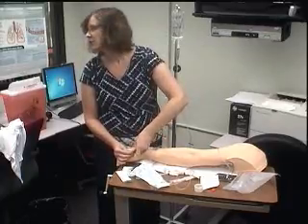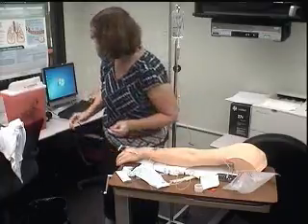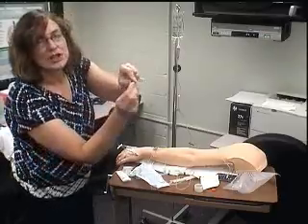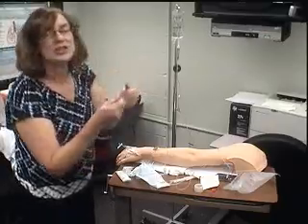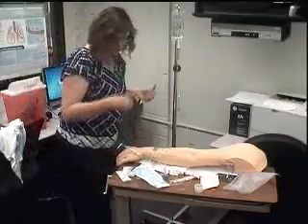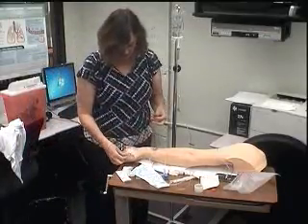Usually it's like 20-30 seconds. Scrub that hub. Make sure it's good, because I don't know if you notice, there are little grooves all in here, and they can get germy and really gets disgusting. So if you don't scrub this really well, you're introducing germs directly into that person's vessels, into their veins, into their blood supply, which goes to the heart, right? So we don't want that.